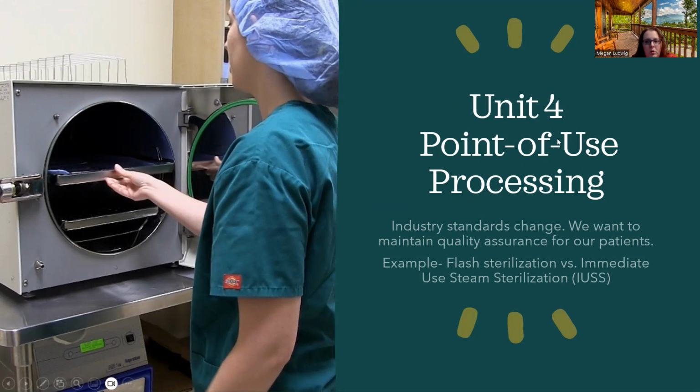So this point of use used to be called flash sterilization. They tried to get away from using this term flash sterilizers or flash sterilization because it was being overused, or abused in a way, that they were using this particular sterilizer for just sterilizing anything that they wanted to without going through the proper steps of going back through the steam sterilizing longer process, really.